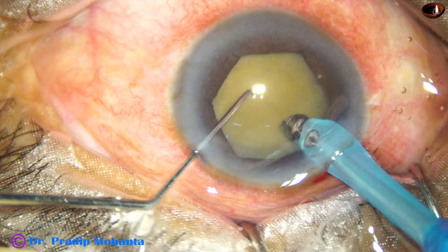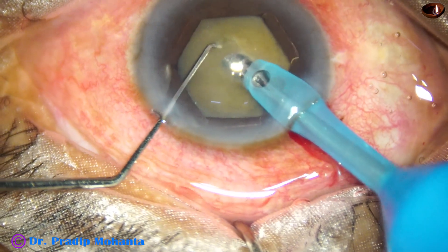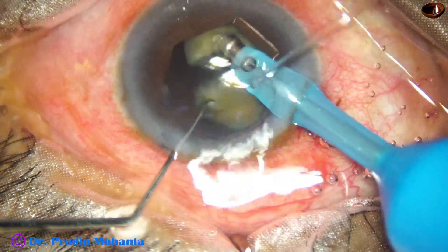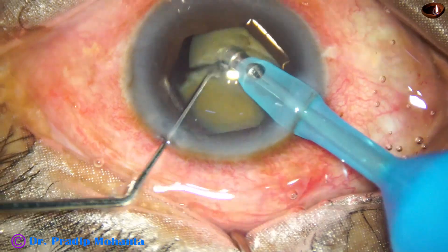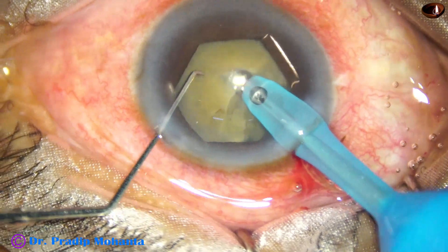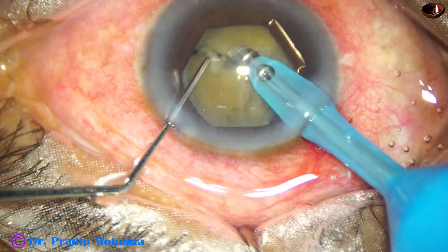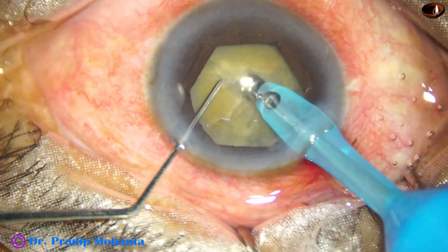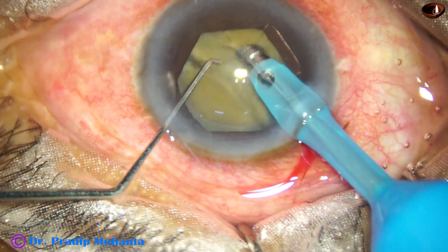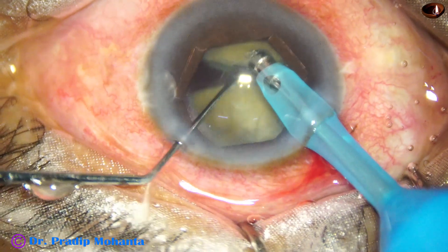Now I am going to divide the nucleus into fragments — sideways. Go into the substance of the nucleus, hold it very firmly, use Mohanthas chopper — the modified Shensky hook — and divide the nucleus. Crack the nucleus; not yet divided into pieces but soon it will be. By this time we have got three fragments.